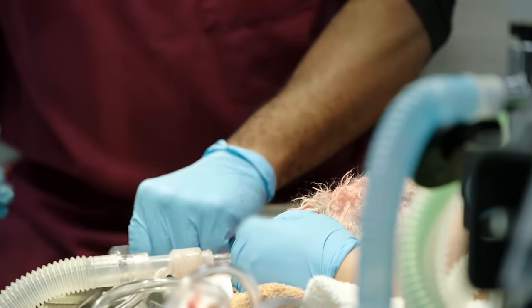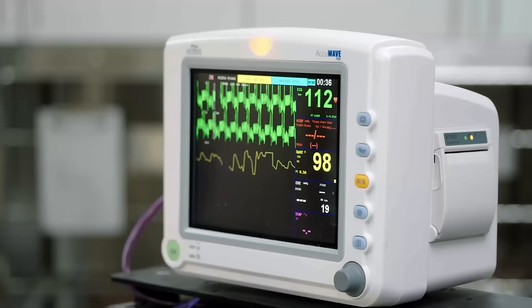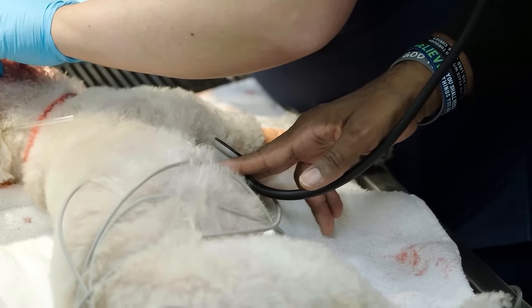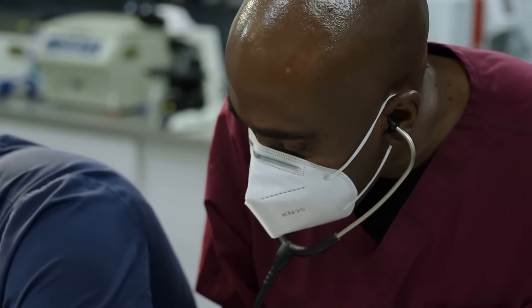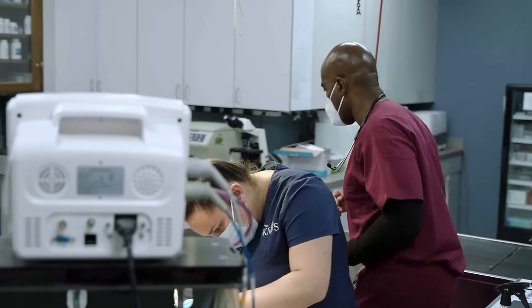Got the teeth that needed to come out so far out. Repaired the fistulas. Now we're gonna get some dental x-rays, make sure everything else looks good beneath the gum surface, and if everything looks good, we're gonna wake him up. But before they can begin x-rays, not hearing that heart rate, there seems to be another problem with Toby's heart. So I want to get Toby up off this table, quick, fast, in a hurry.